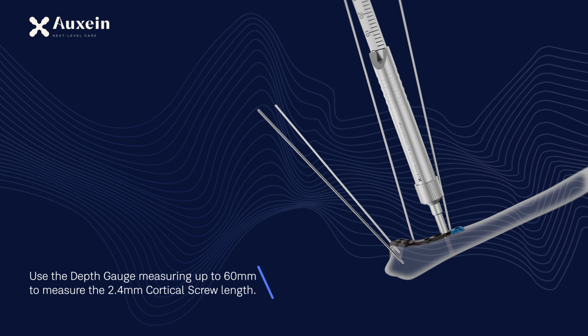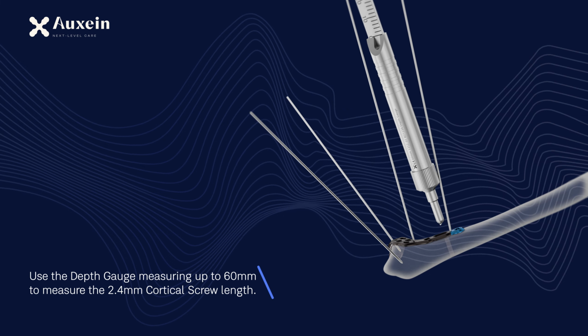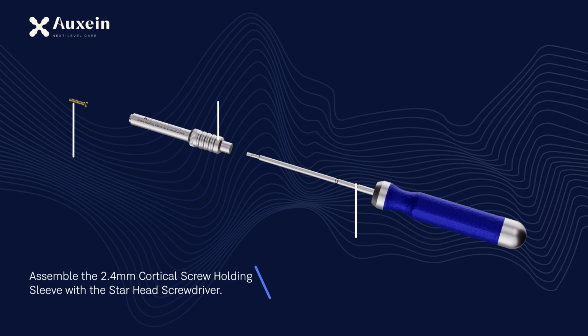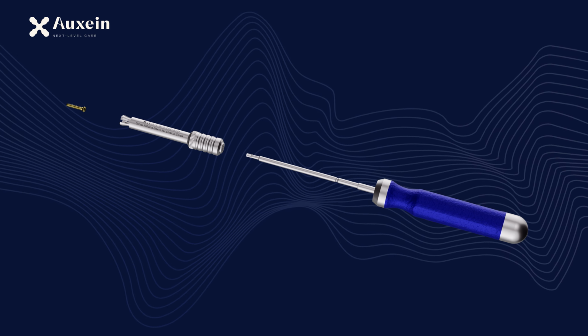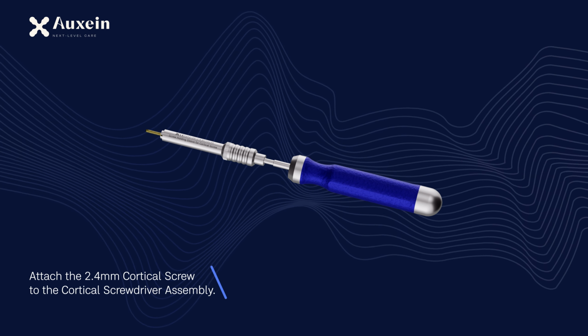Use the depth gauge measuring up to 60mm to measure the 2.4mm cortical screw length. Assemble the 2.4mm cortical screw holding sleeve with the star head screwdriver. Attach the 2.4mm cortical screw to the cortical screwdriver assembly.